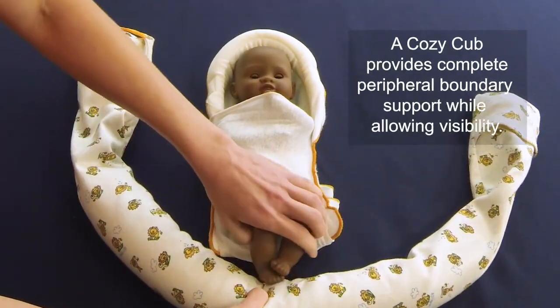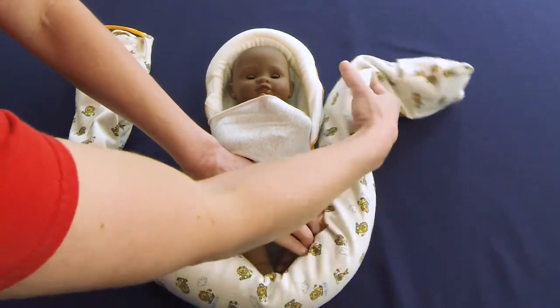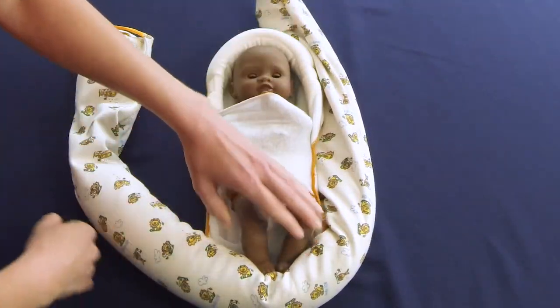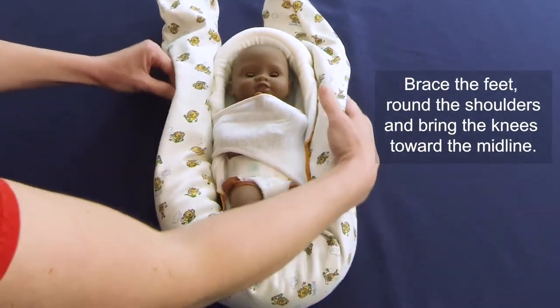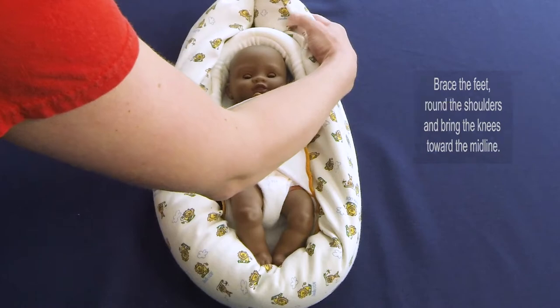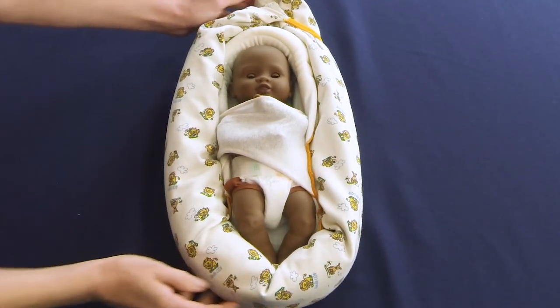The Cozy Cub is a larger, non-occlusive boundary that provides supportive containment around the entire periphery. First, shift the weight of the Cozy Cub so that most of it rests at the baby's feet, then firmly brace the soles of the feet against the boundary. Tuck the Cozy Cub against the infant, taking care to provide support under the shoulders, against the torso, and around the head.